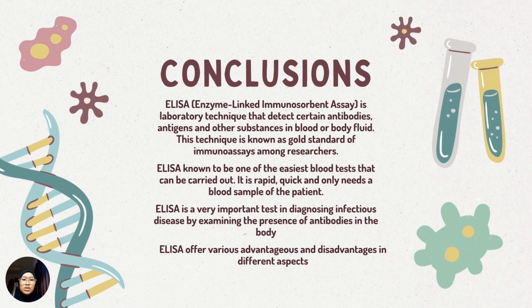It is a very important test in diagnosing infectious disease by examining the presence of antibodies in the body and offers various advantages and disadvantages in different aspects.